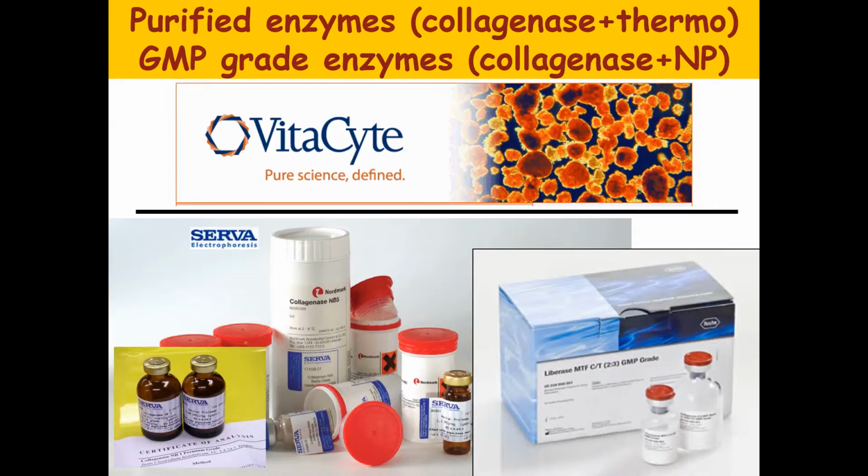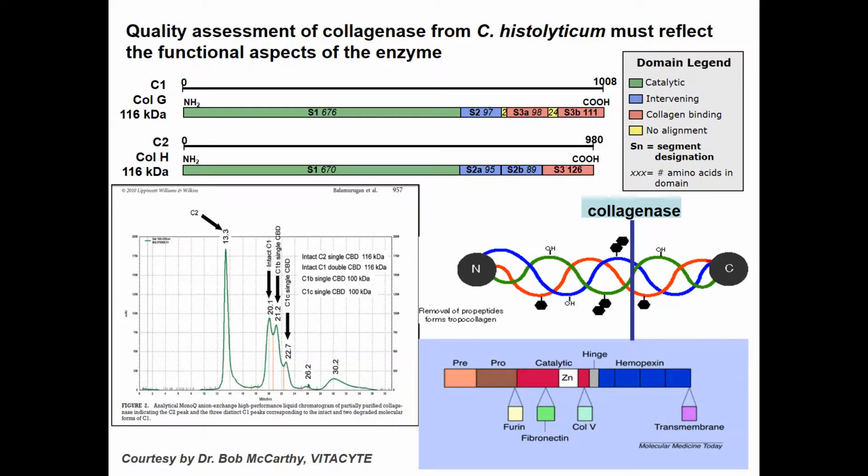Among the labs, generally, it's very difficult to really pick which protease. Collagenase is common in all three companies, but what is the best protease for chronic pancreatitis pancreas? Because these enzymes are commonly designed for isolating islet cells from brain-dead donor pancreas for allo-transplantation. So we did extensive HPLC analysis of the biochemical properties of these collagenases and proteases, and studied the binding properties of these enzymes.